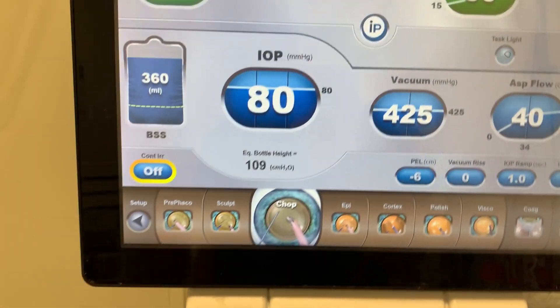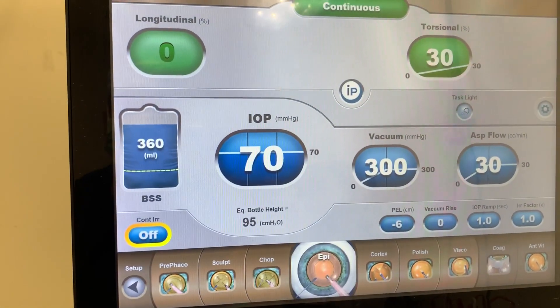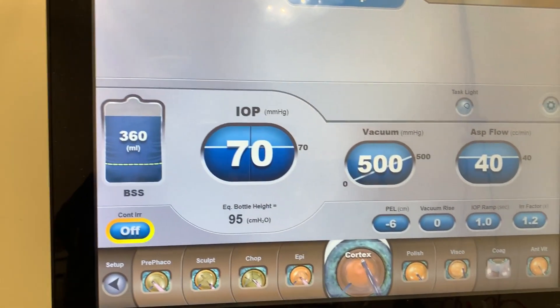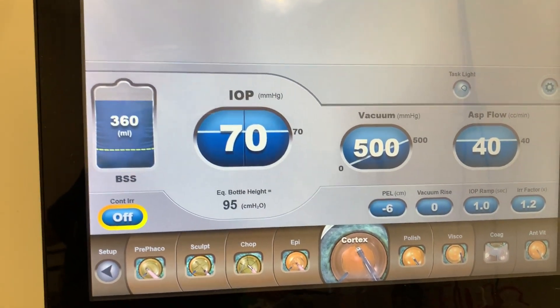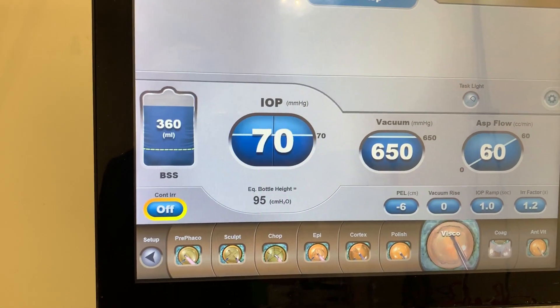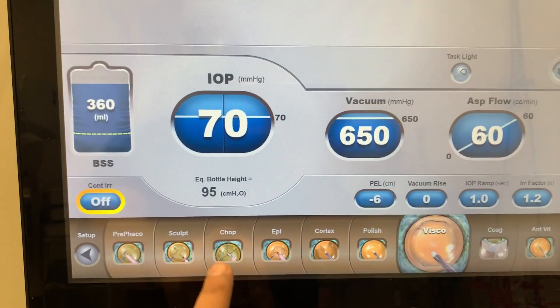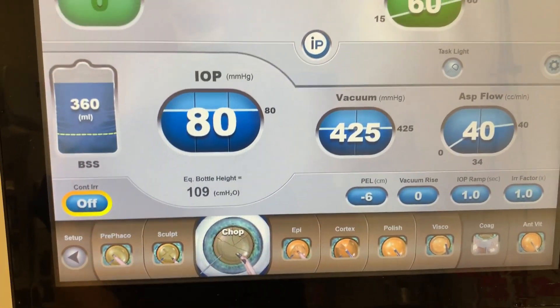I'll start on chop, then double-tap the pedal to go to cortex, and at the end of the case double-tap again to go to visco. That way I have all settings available but only use those three for most cases.